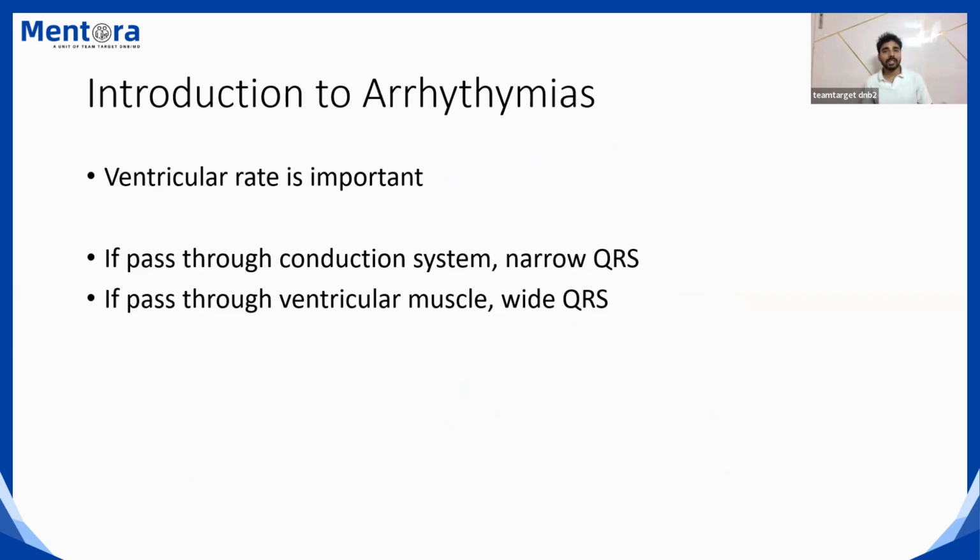Before starting arrhythmias, the first point I want to mention is that in any type of arrhythmia, ventricular rate is important. That's a very, very crucial dictum point. Ventricular rate is important. That means atrial rate is never important. So what does it mean? How fast the atria beat doesn't matter to you. You are not at all bothered about this. Your concern is the ventricular rate.